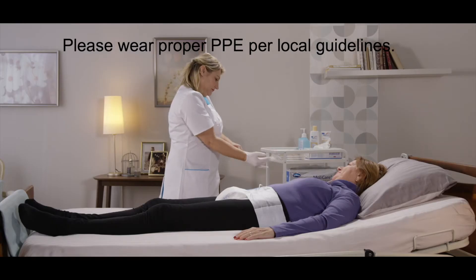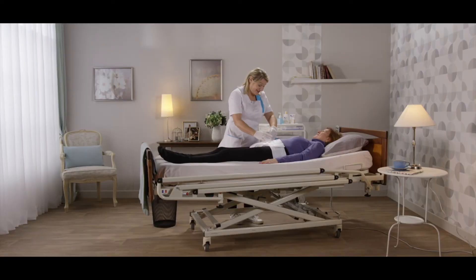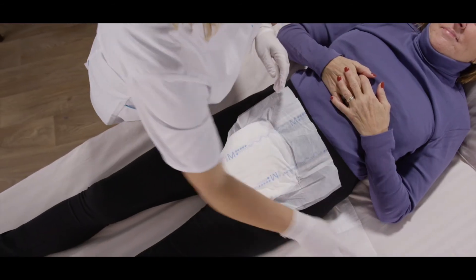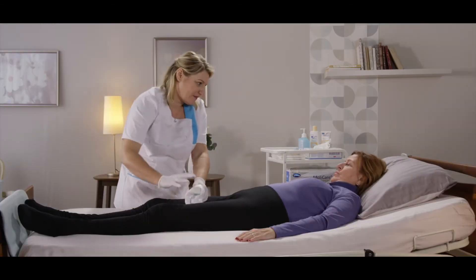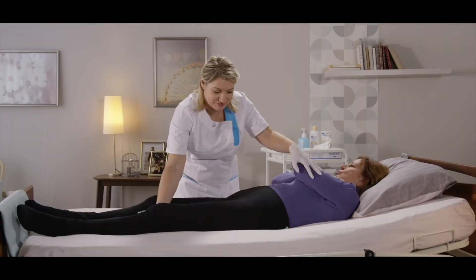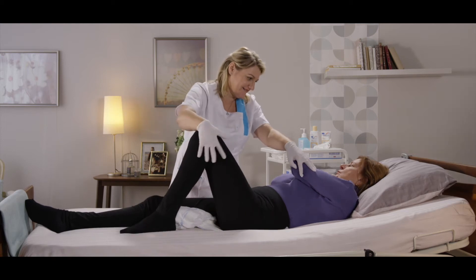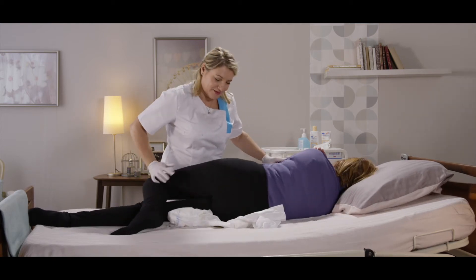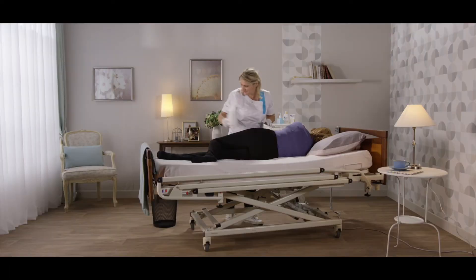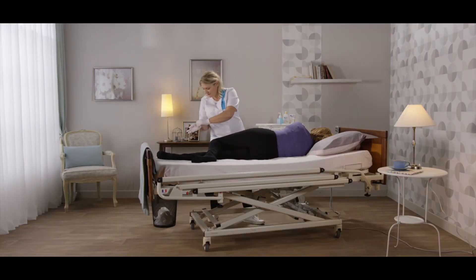For product removal, unhook the tabs in the front and roll the front of the brief onto itself. Place the resident onto their side towards you. Remove the brief from front to back and properly discard the soiled brief.